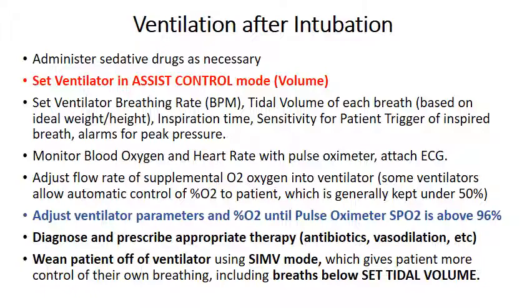So once intubation has happened, which means a tube bypasses the epiglottis, which is the thin fold of skin which normally keeps any kind of food from going into your airway, into your lungs, the intubation tube basically ensures that the air from the ventilator is going to go into the lungs. No chance of it going down the esophagus.